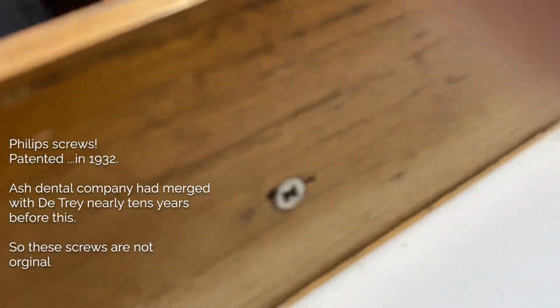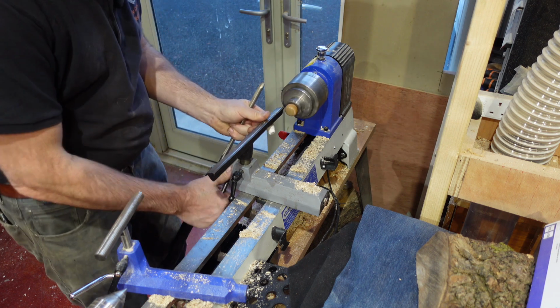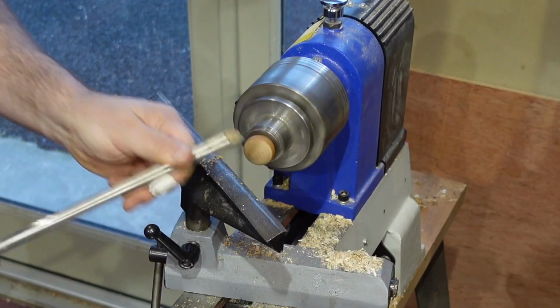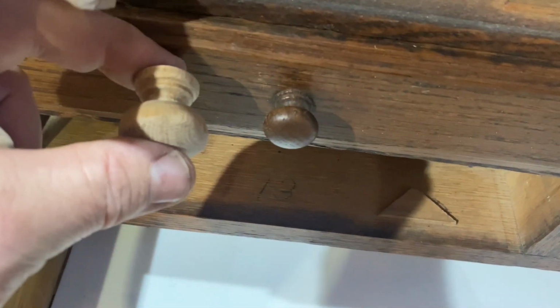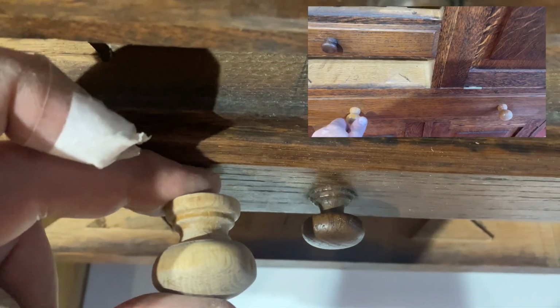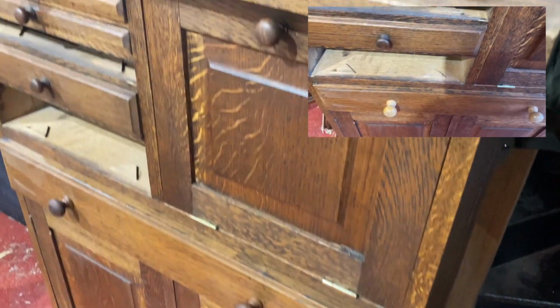Here's another clue that these are modern. If we come in here and have a look. So these are a little bit closer in terms of aspect and shape. Now I just need to make them the same colour. So they look a lot more in keeping now.